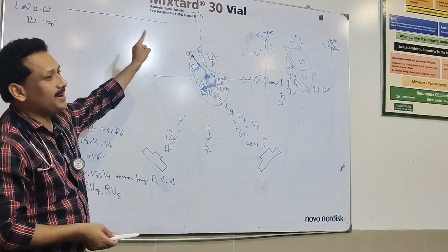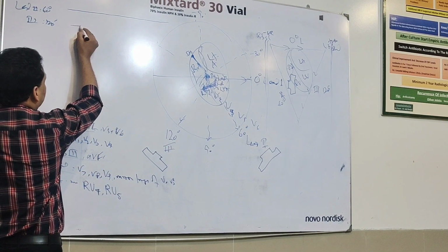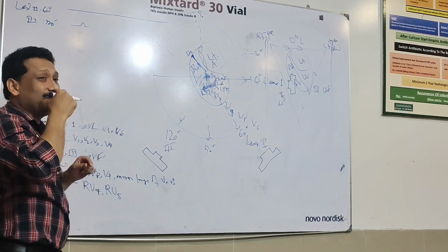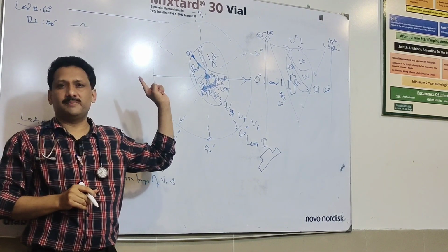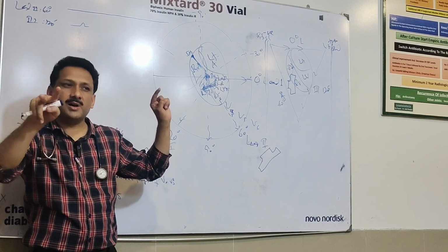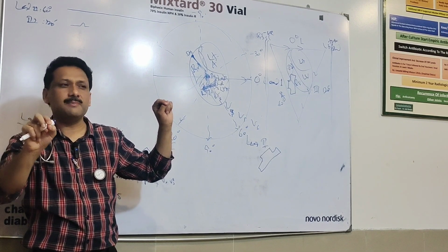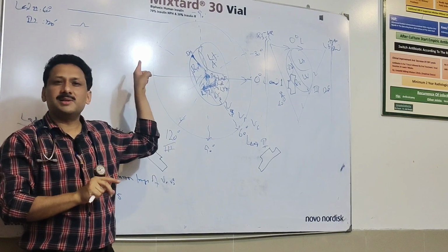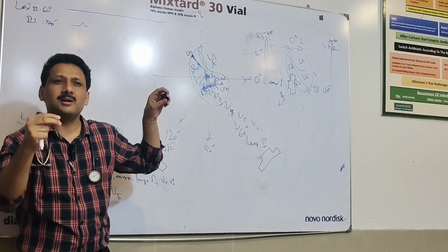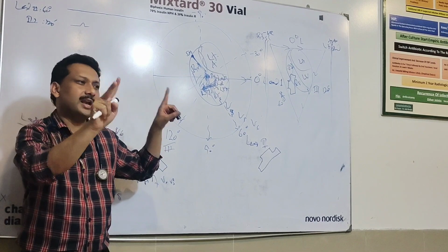How do these things happen on that ECG paper? As the heart starts beating, the first wave formed in a normal person is known as the P wave. What is it interpreting? It is interpreting atrial contraction. The two atria work together, contract at the same time, and ultimately form this wave. So what is happening in the heart? There is atrial depolarization leading to contraction of both atria.